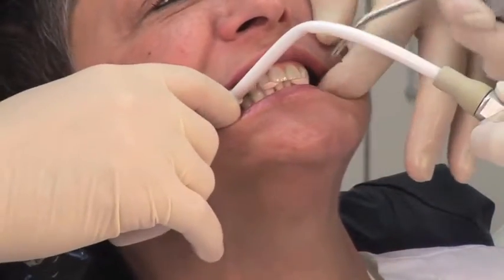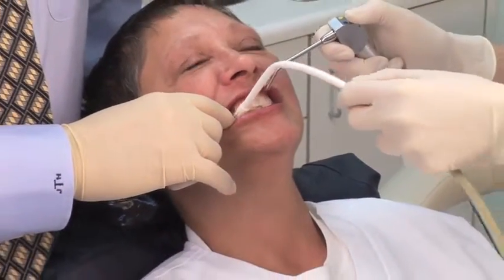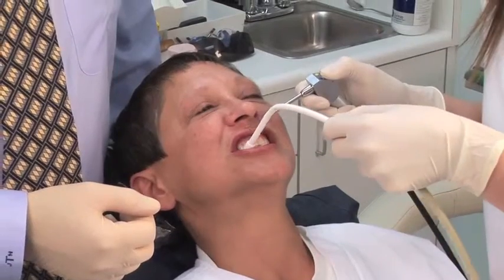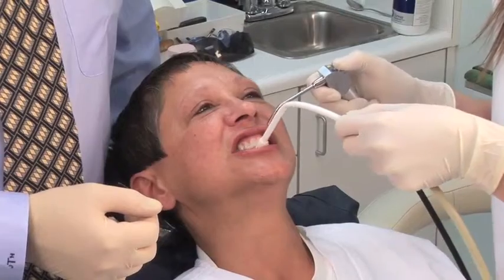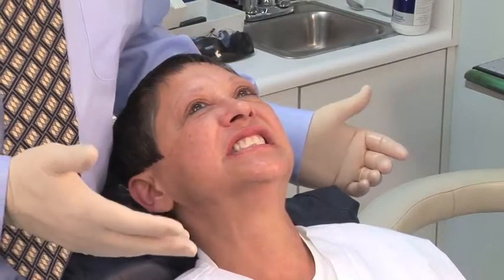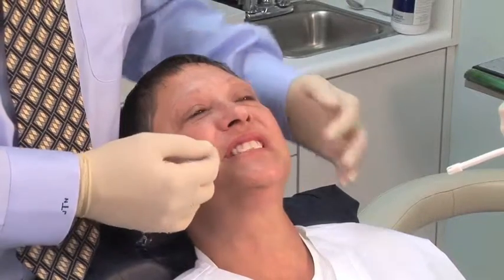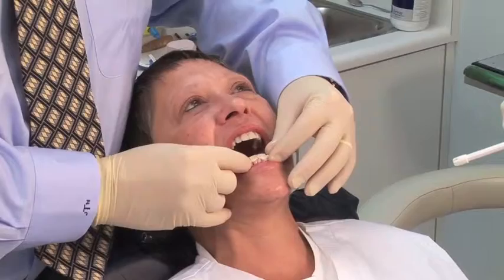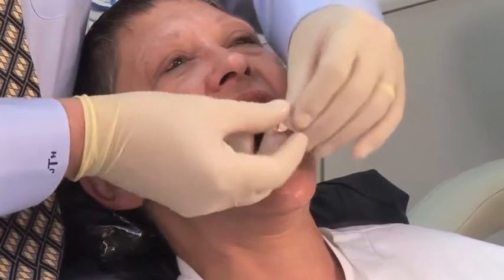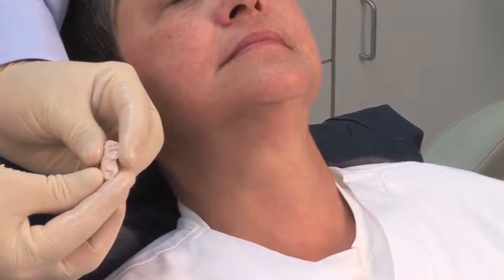So we're going to take a suction, and Morgan's going to use some water to chill it. Have the patient open and close a few times to verify that you're in your CO bite. Verify that your cool water has initiated the set of the material, and simply remove from the patient's mouth. This is now what I am calling a CO repositioner that the patient can use every morning.